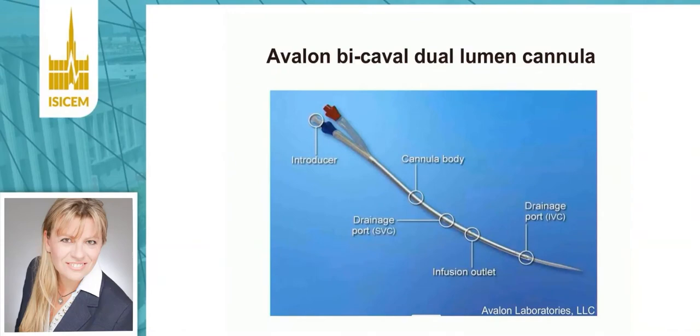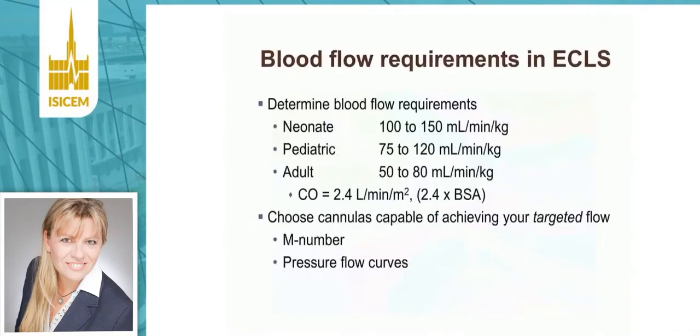There are some blood flow requirements in ECLS, and it's really important to determine them depending on the age of the patient and their weight. It's also important to know, for example, the pressure flow curves and pressure drop compared to the diameter of the cannula.